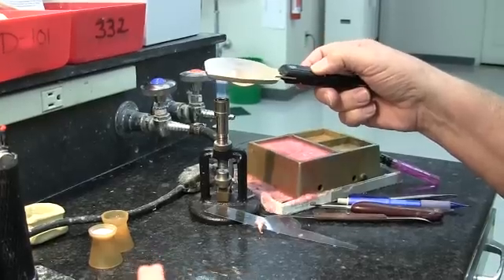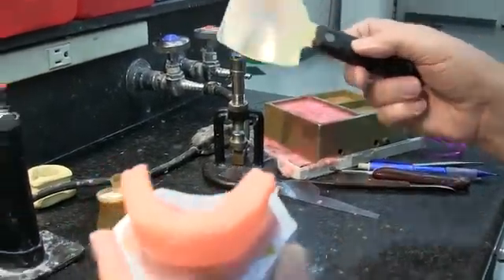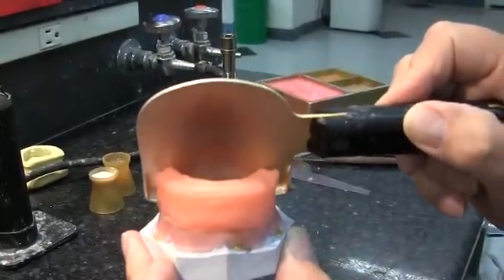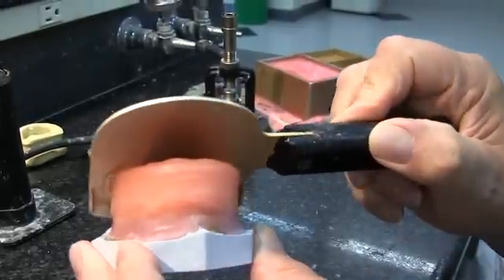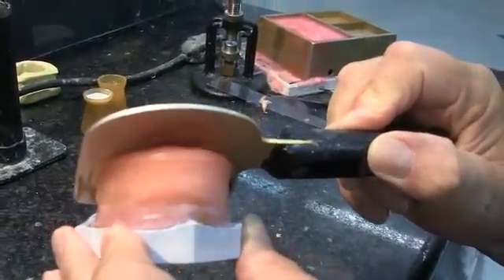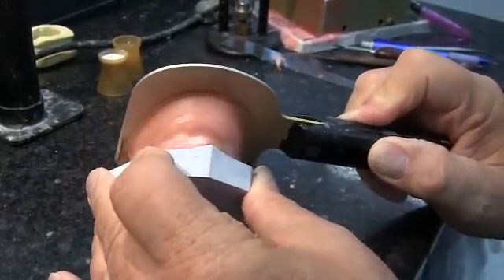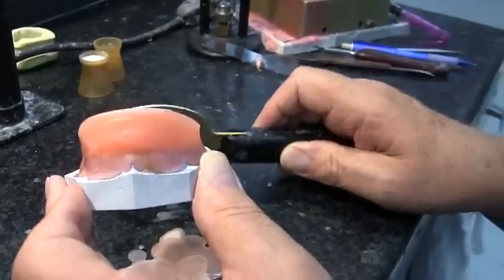Now we're going to begin to heat our rim former up so that we can place it on there and melt the wax down to the level that we want, which will be 22 millimeters in the anterior. We can see our mark. We place that in and begin to push it down — sometimes you have to heat it pretty well to be able to do that, and it may take more than one pass.